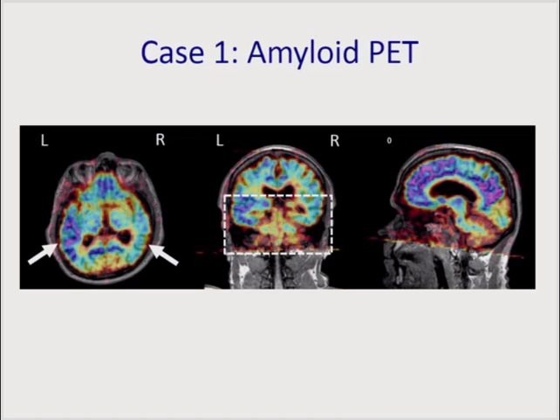If you look at the temporal lobes, laterally more than medially, consistent with the path literature, you're seeing elevated amyloid burden. Along the midline, this is really striking, at least to me. There's a lot of amyloid deposition, especially in the posterior cingulate and precuneus, relative sparing of the pre- and post-central gyri here, and again a lot of amyloid burden along the midline in the frontal regions.